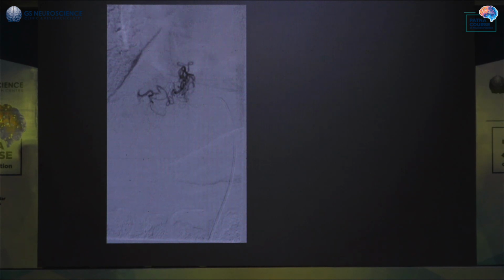The most interesting technique that works for me is this. Generally you put your wire, but don't put your wire, because getting through these tortuous vessels is not possible with the wire. But with your flow-guided catheter, like a Magic 1.2 F or FM, you can push it forward ahead of your micro wire, and the micro wire can act within the catheter like an accordion.